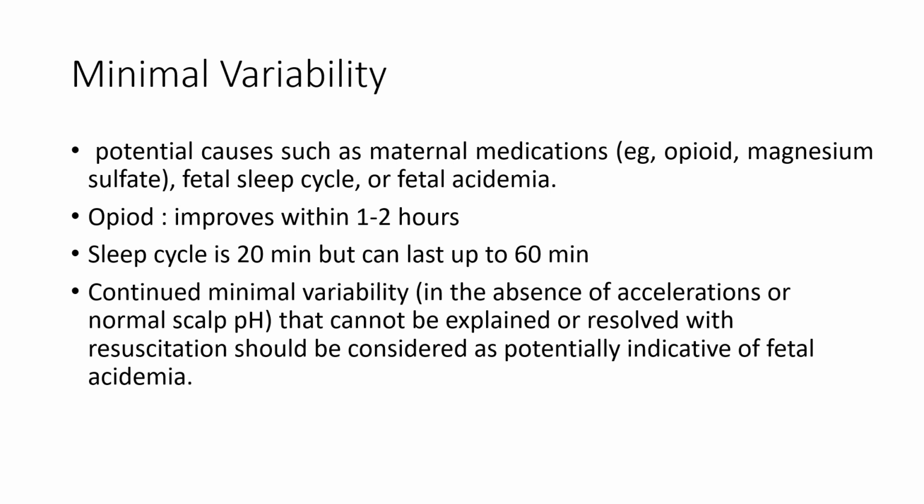In case of opioid intake, the minimal variability usually improves within 1 to 2 hours from the intake of the medication. The sleep cycle is usually 20 minutes, but doesn't last more than 60 minutes. Continued minimal variability in the absence of acceleration or normal scalp pH, which cannot be resolved with resuscitation, should be considered as potentially indicative of fetal acidemia.